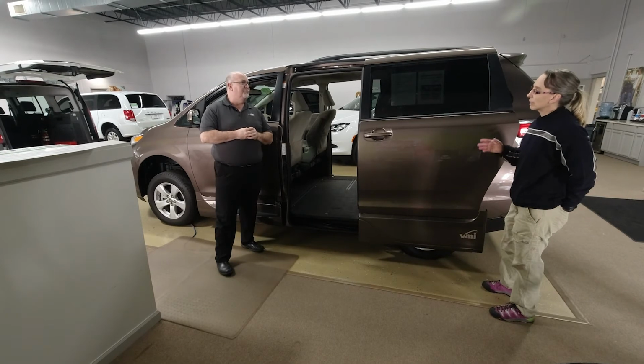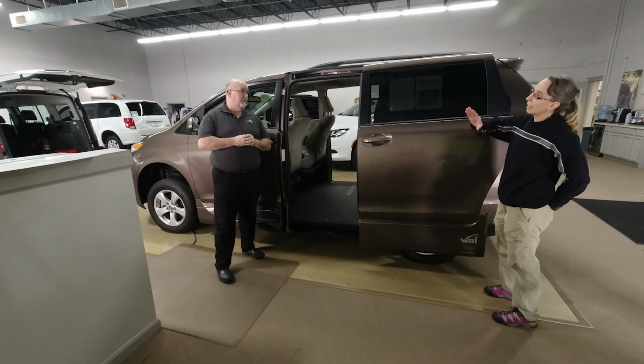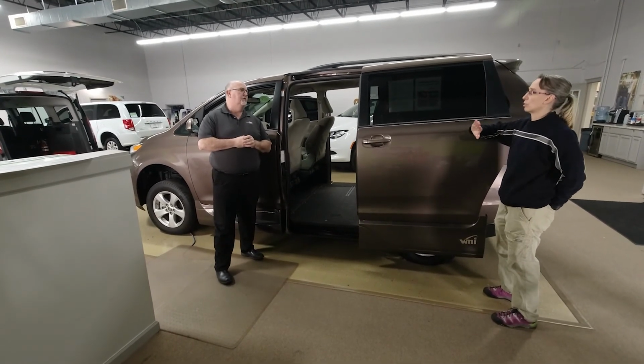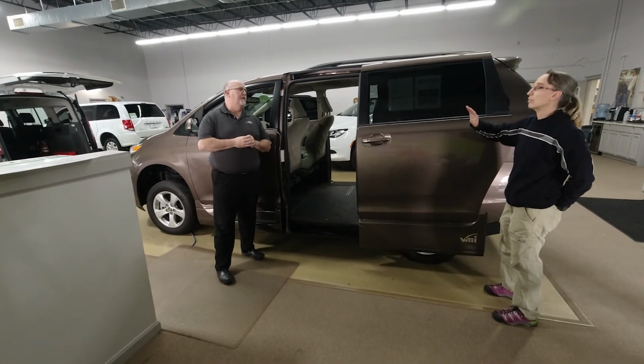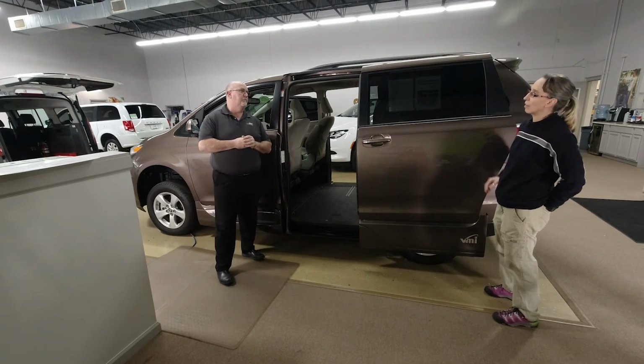Because I've had clients in a power wheelchair that had to recline way far back to be able to get into their vehicle. And so that was the clearance issue. Absolutely. And so that was a height issue problem. A height issue. And I do think that family ended up raising the height of their van to be able to get their son in and out easily.